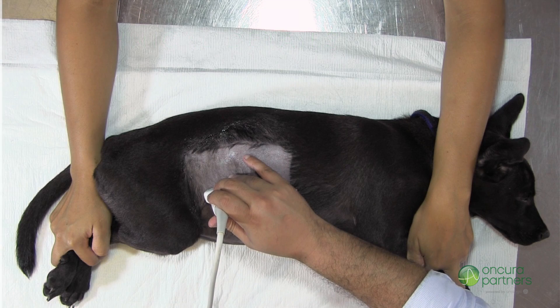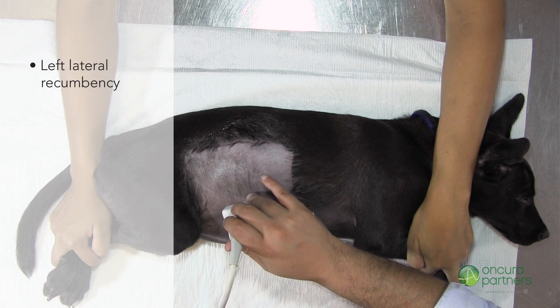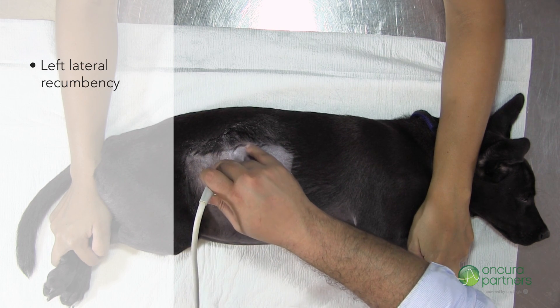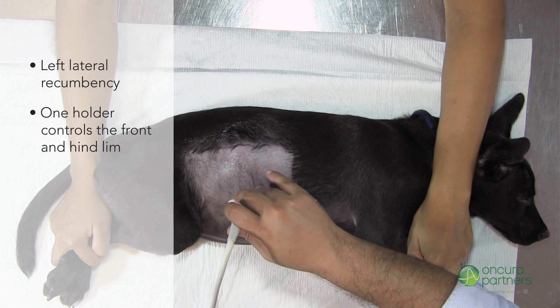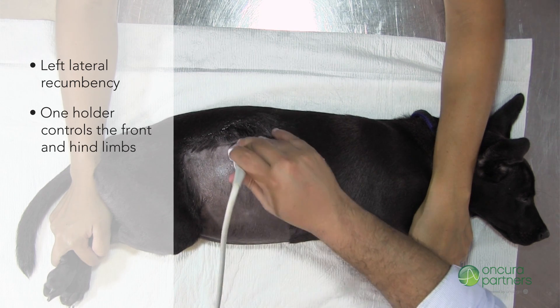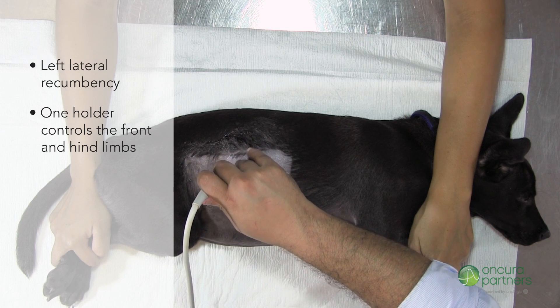For this technique, place the patient in left lateral recumbency with their legs directed towards the sonographer. This position will allow one person to have complete control over the patient's front and hind limbs while the sonographer performs the ultrasound.